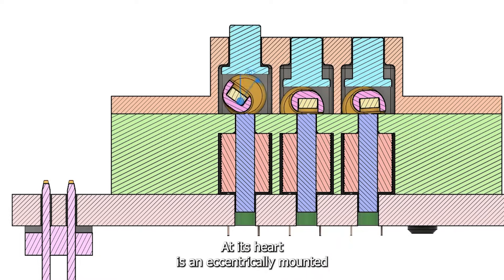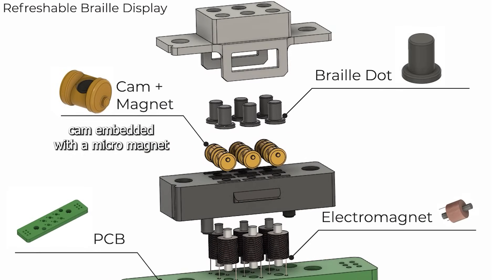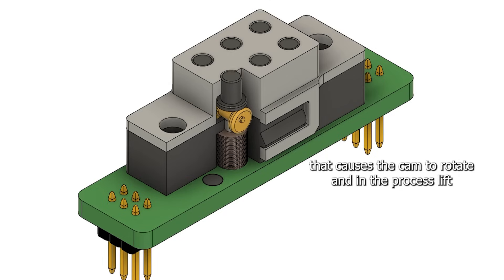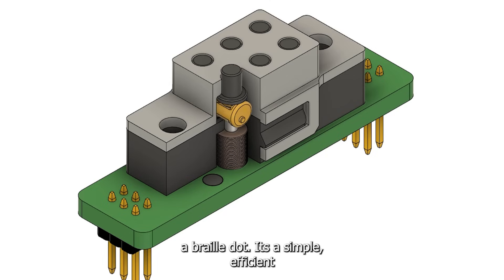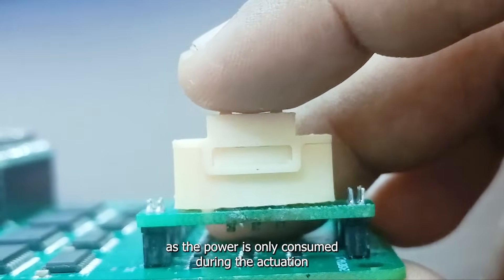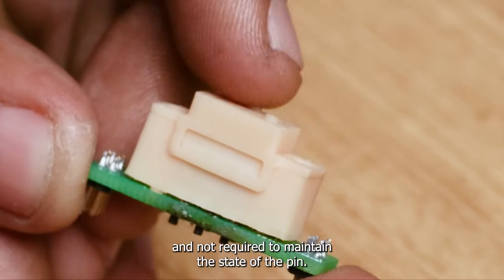At its heart is an eccentrically mounted cam embedded with a micro-magnet that is influenced by an electromagnet, causing the cam to rotate and in the process lift a braille dot. It is simple and efficient, and ensures low power consumption as power is only consumed during actuation and not required to maintain the state of the pin.